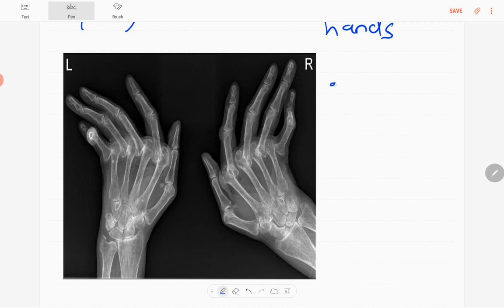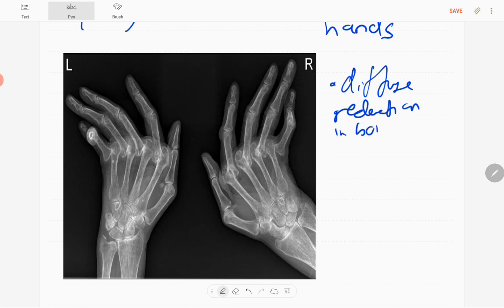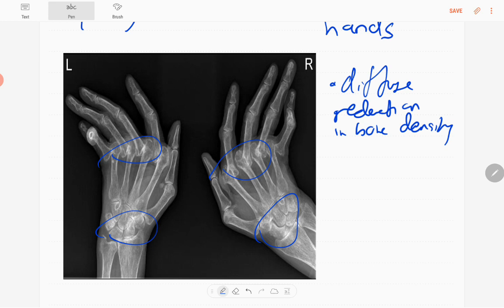You can see diffuse reduction in bone density with a coarse trabecular pattern. There are multiple joint abnormalities involving the wrist joint or radiocarpal joint, metacarpophalangeal joints, and proximal interphalangeal joints. The distal interphalangeal joints are relatively preserved.